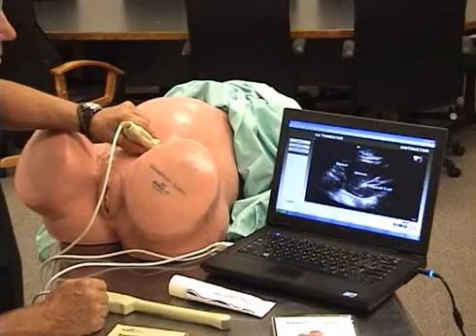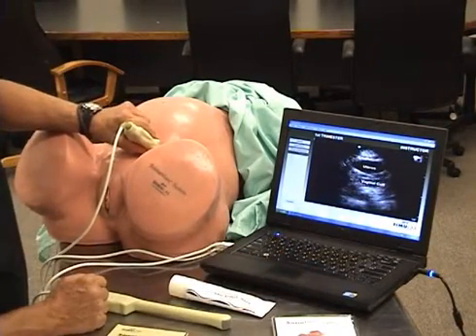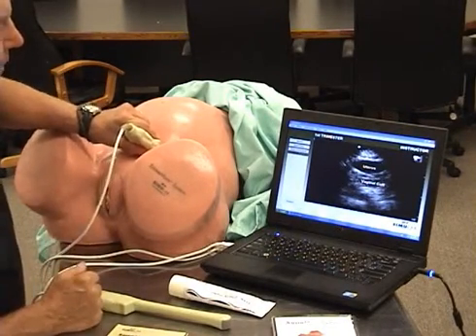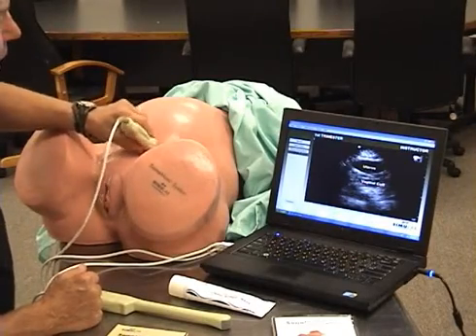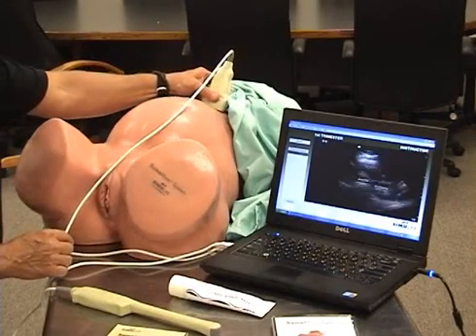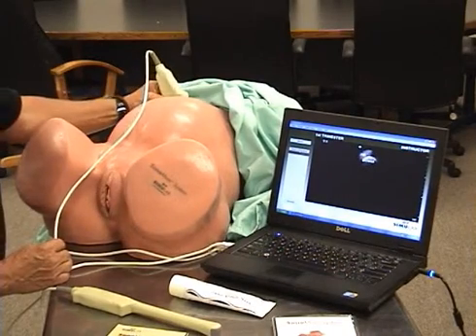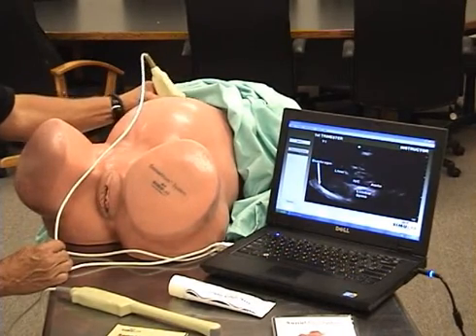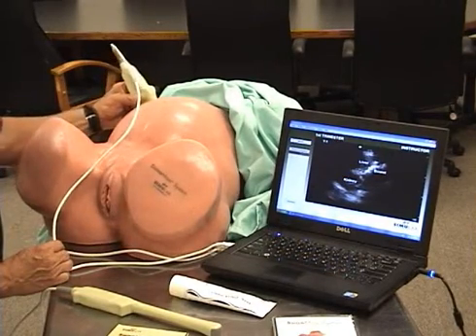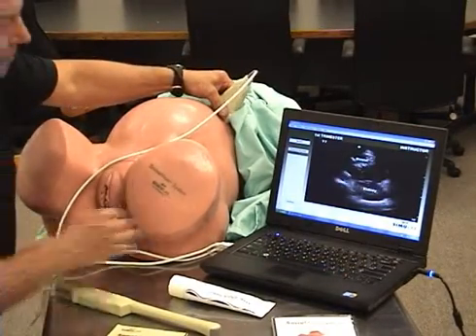I get a different view of the longitudinal view and a different transverse view of the same patient with the same potential diagnostic imaging issue. I also want to show that with 147 locations throughout the body, I'm moving the probe superior to the diagnostic area, and you'll see that I can show students what they're actually seeing under ultrasound.